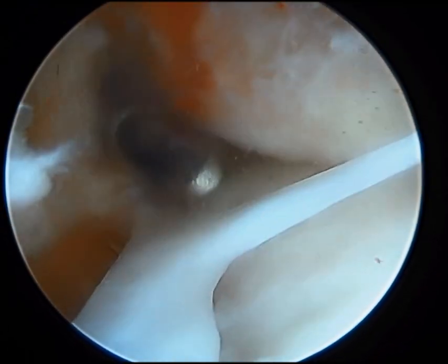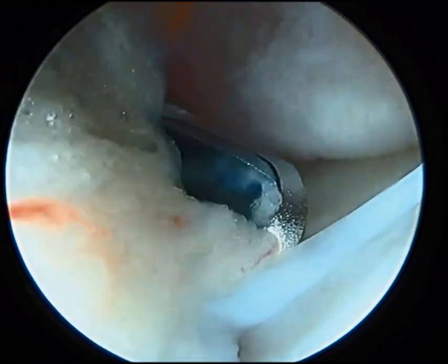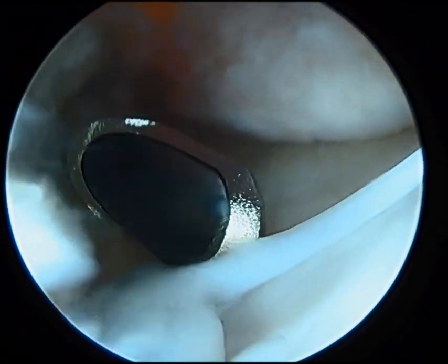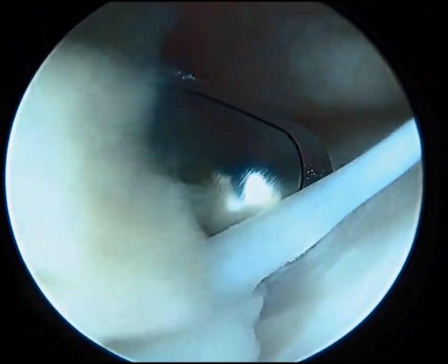This is a short segment of an ankle arthroscopy in which we are debriding a fibrous band that is causing an impingement during ankle range of motion. This causes pain and sometimes locking up of the ankle during activity.